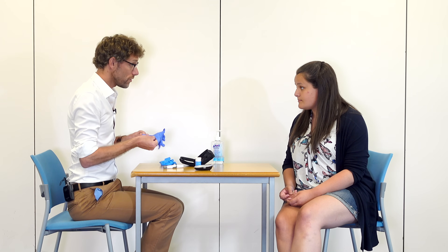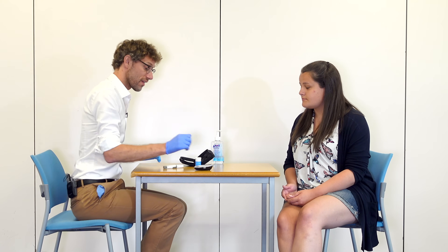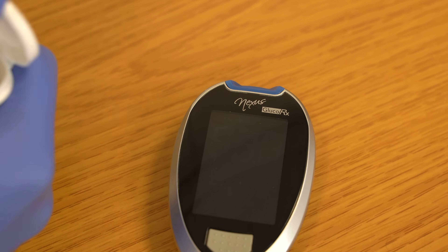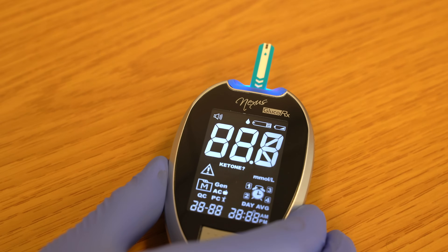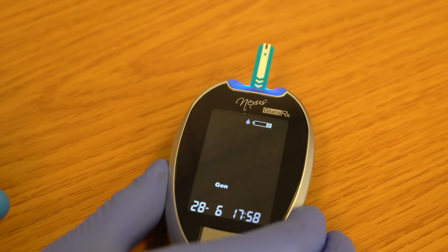I'm just going to put my gloves on. Now, when you do these at home, it's vitally important to make sure you do wash your hands. Because if, for example, there's some sugar or anything like that on your fingers, then that can adversely affect the result. So we're going to open up the test strip and put it electronic side in — that should wake everything up. We'll wait for it to say it's ready. We can see that it's ready to accept the blood.